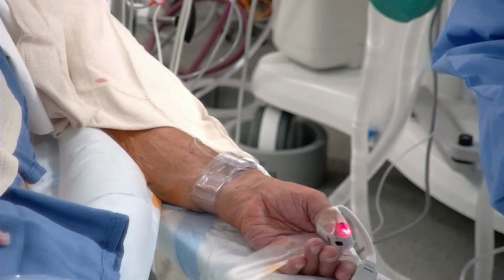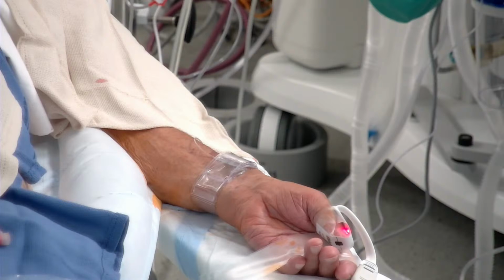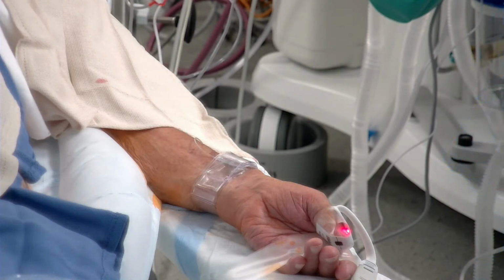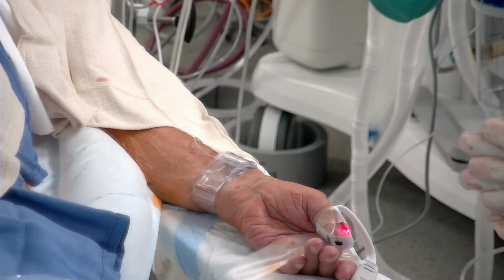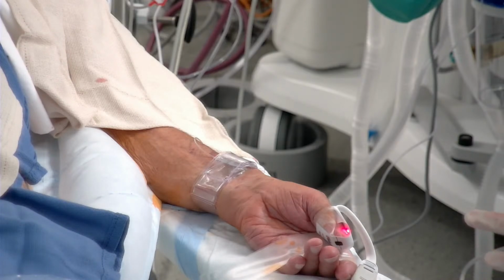And so this will stay on for about an hour and a half. That gives them enough time to recover in our recovery area, and then we'll take it off slowly. So usually we'll let out a few cc's at a time over a few minutes. Obviously, if it starts to bleed, we'll blow it back up to that 14 cc's, and then leave it on for another 30 minutes. I would say the vast majority of patients don't need that extra time, even with a blood thinner or low platelets.